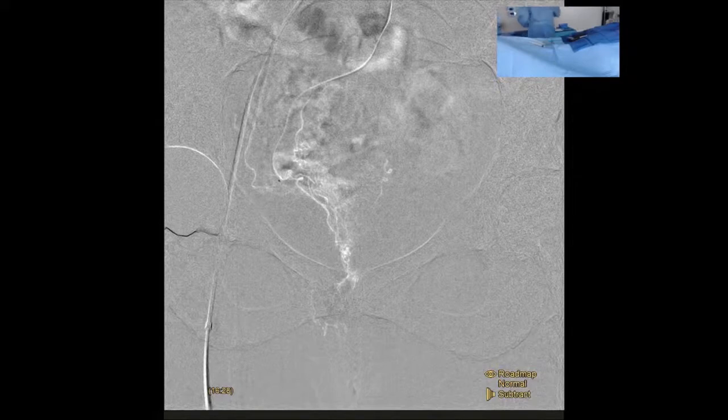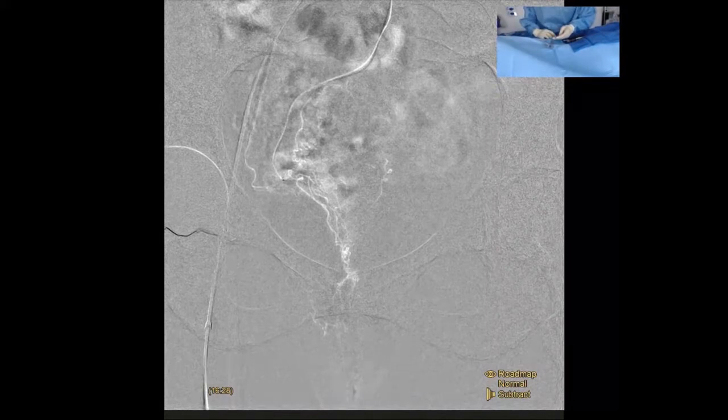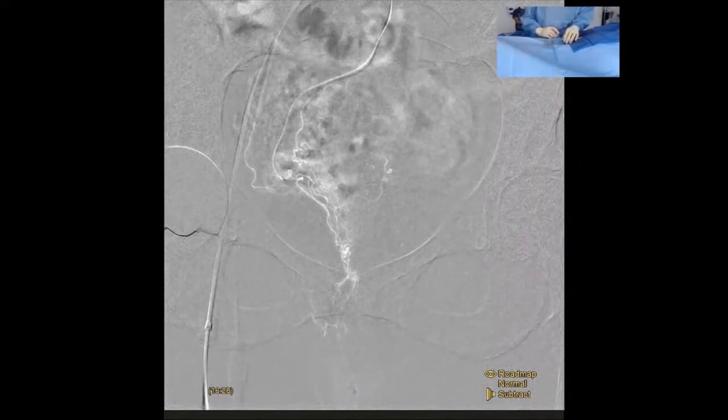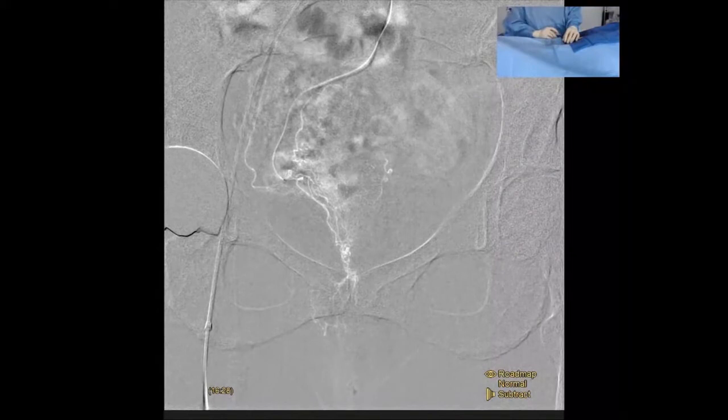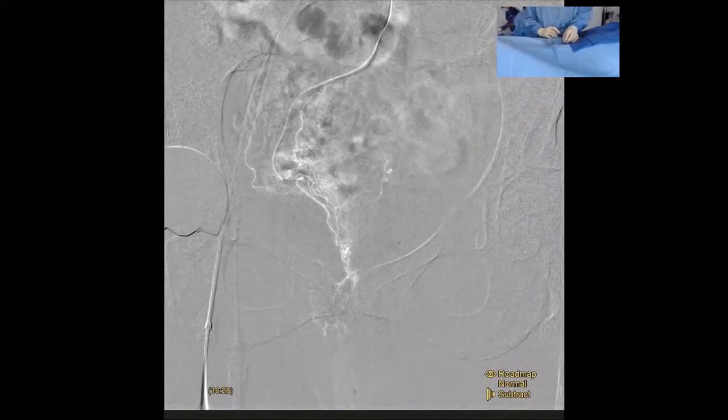First thing we're going to start here, while we're getting that coil ready, is our particulate embolic. Yeah, so what are we using for embolic today? So we're using Bead Block today, and we're only going to deliver such a small amount. The reason we use a small amount is we just fill the hub and then a little bit of the catheter, so you're not even pushing through all the dead space. You're just putting 0.1 or 0.2 cc's. Absolutely. Just filling that hub, and like you mentioned, 0.1, 0.2, and then delivering antegrade.